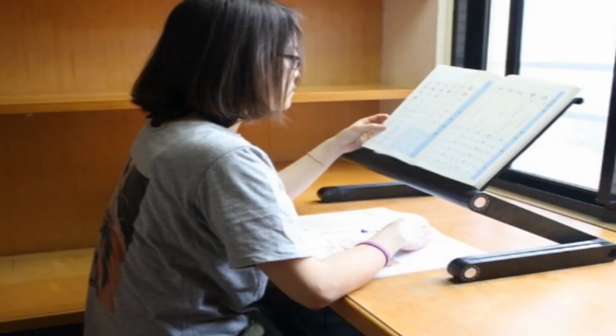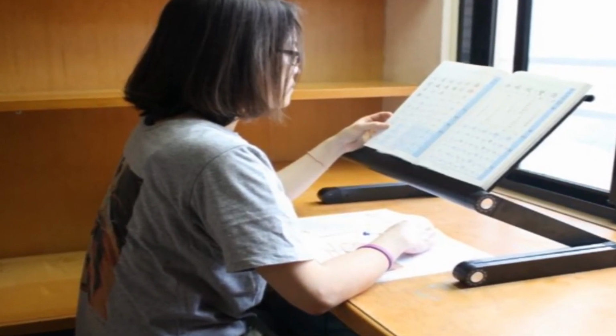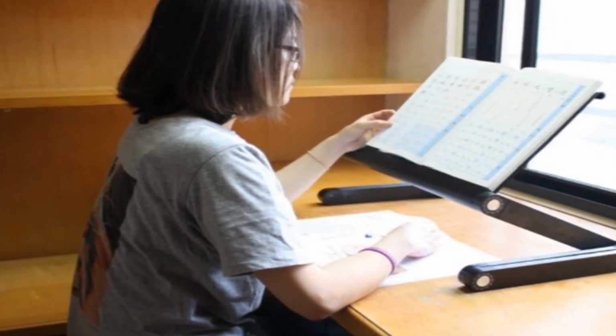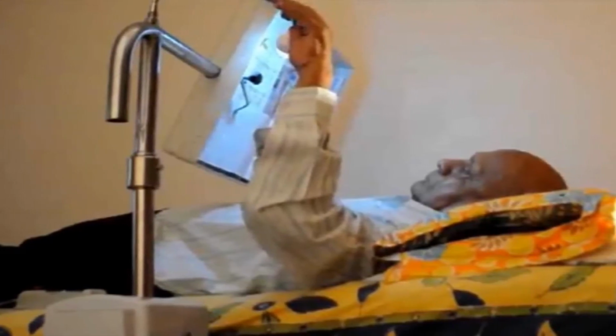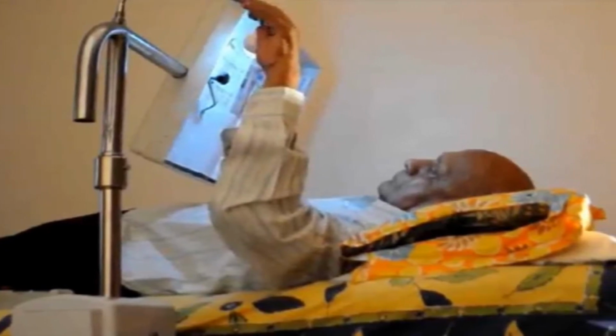Reading stand. It is used to hold the reading material in a comfortable position so that the patient can read without straining the neck and back muscles or tiring the arms. An adjustable lamp can also be added to help reading for extended periods. It is used to reduce the distance between the object and the reader.